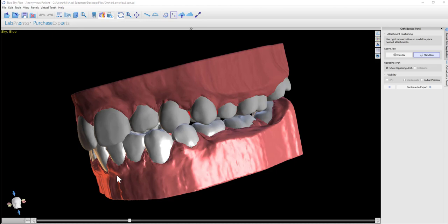Adding button attachments is easy. Simply right-click on a tooth and click Add Button.